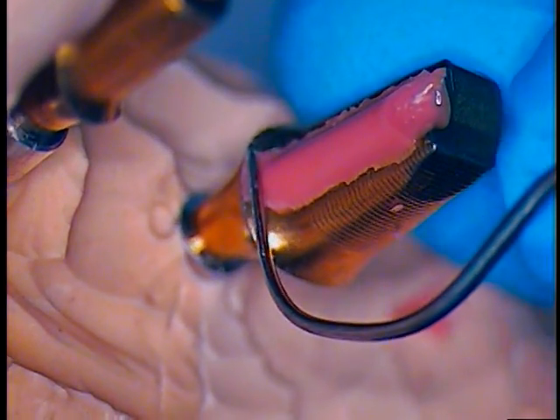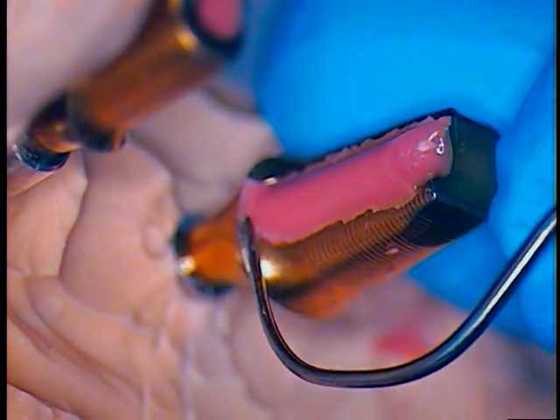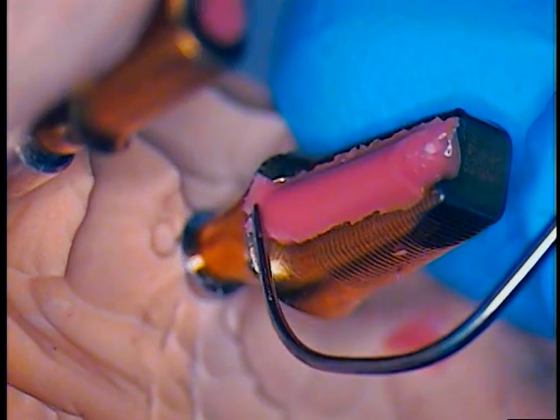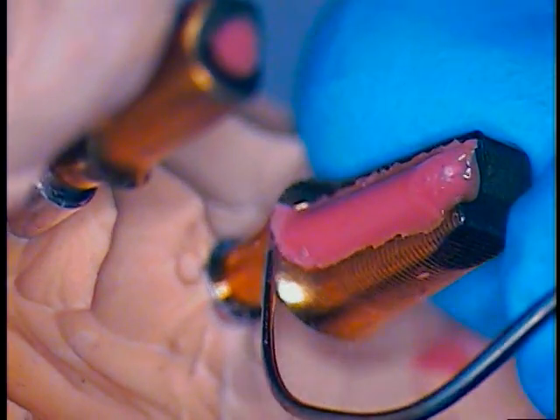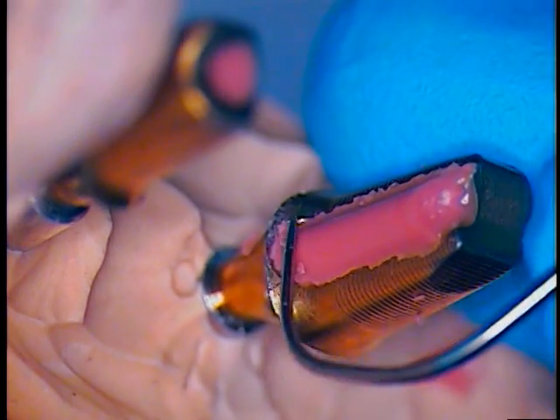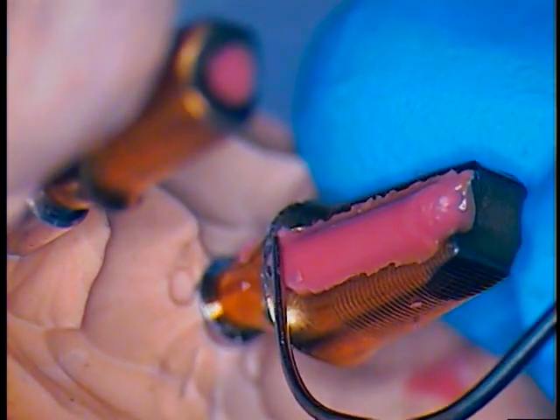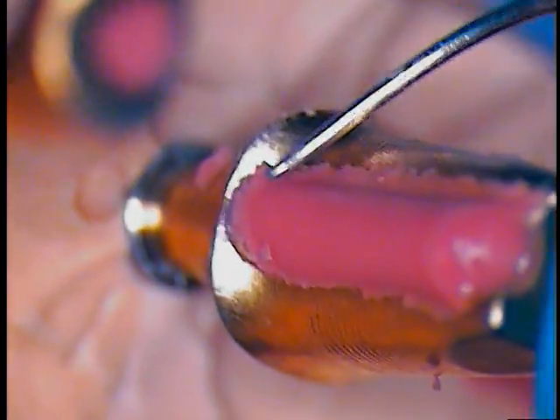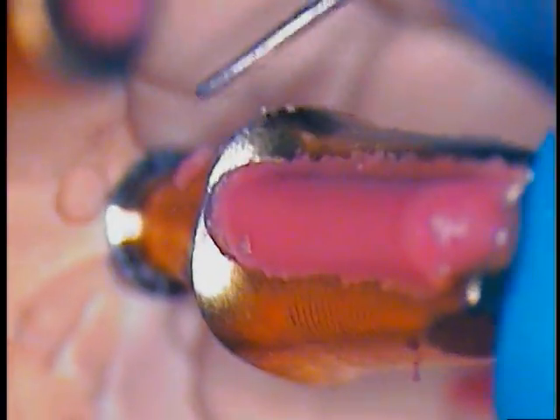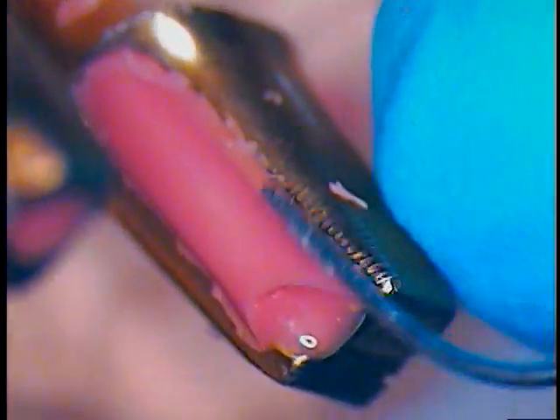And we'll have plenty of seal. Let's make sure you have a hermetic seal. You can see where the screw vent hole runs right about here. And then we'll have plenty. See, with a microscope you can actually do a hell of a lot more work — a lot more work. Close up and a little more precision with everything.